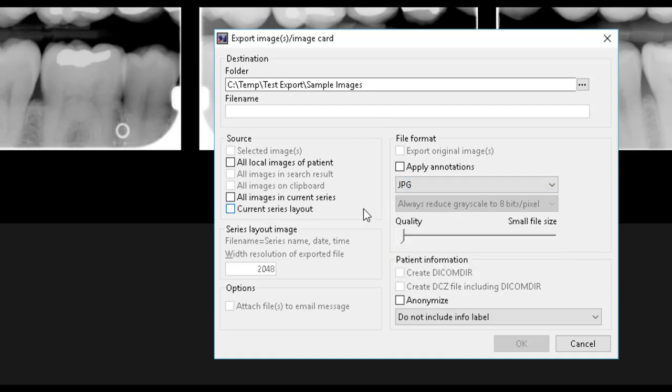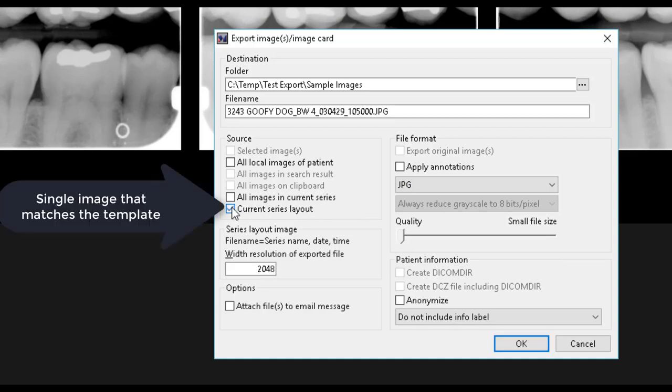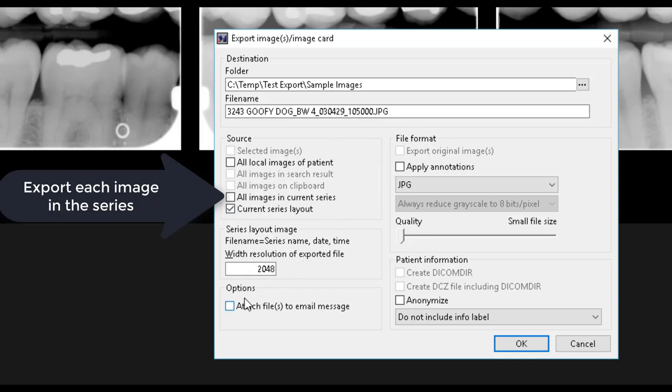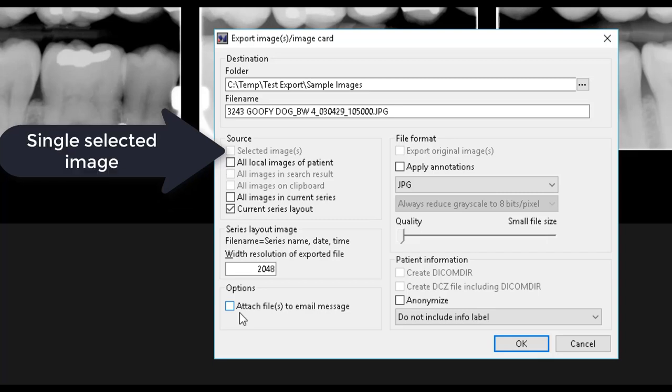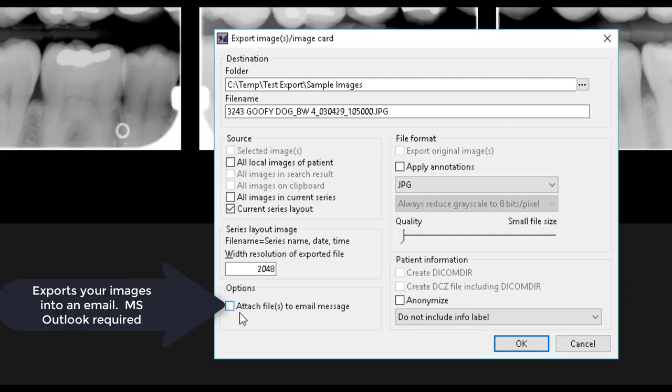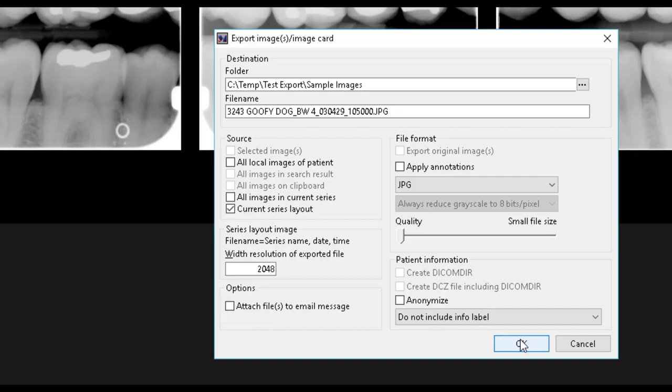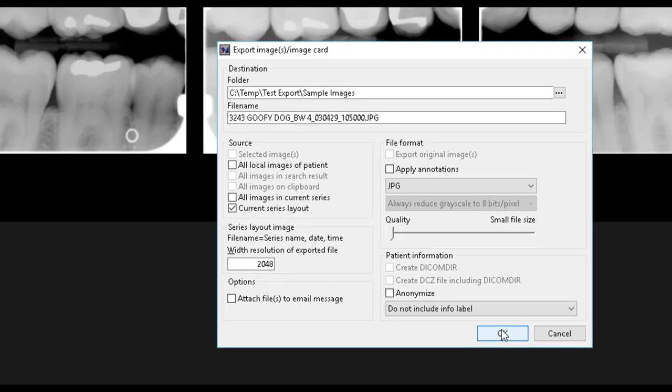The Current Series Layout option produces a single image that matches the template you are currently viewing. All other options produce a single file for each image in the selection. If you wish to attach the exported images to an email message, you can select this action under the Options section. This will automatically open your email client and attach the exported image files directly to the email. After you have made your selections on the Export dialog, select OK to initiate the export.